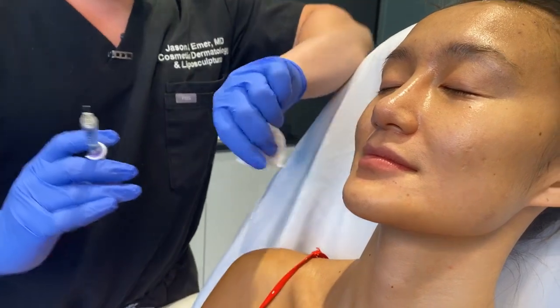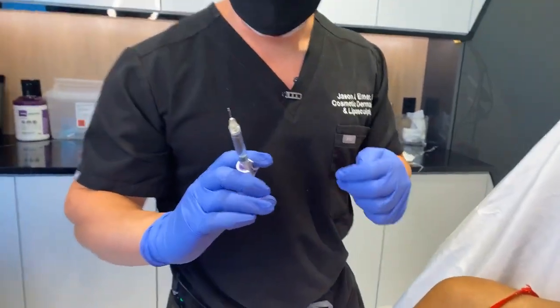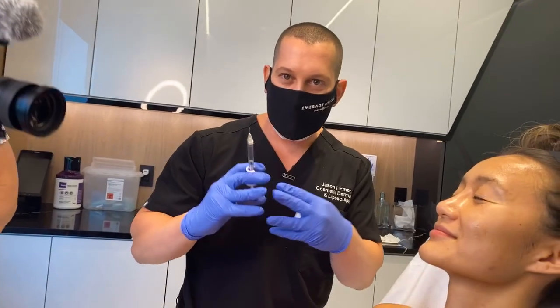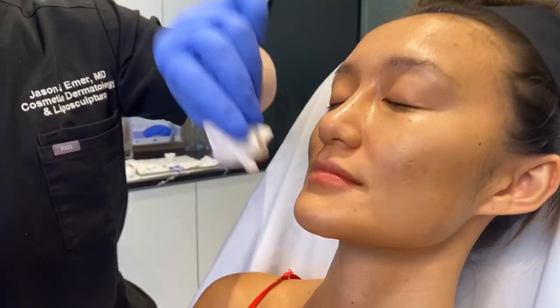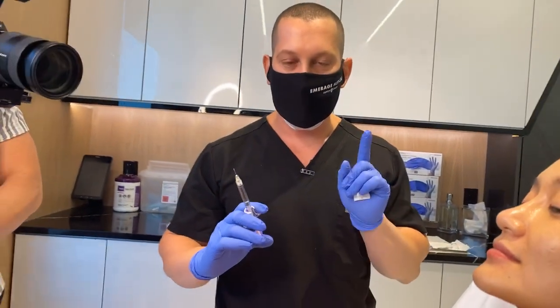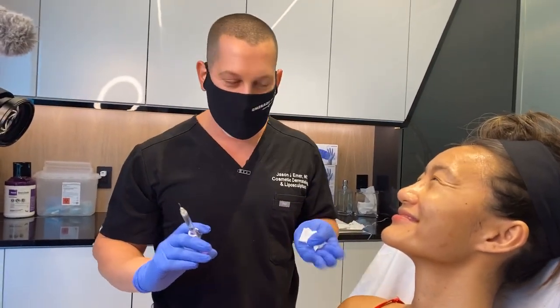They asked me anything? Yes, they asked. This is Juvederm VOLLURE. It's one of the longer lasting of the Vycross technology fillers. That's just a special type of cross-linking that makes the filler last longer. Now, just so you guys know, if you do a little research, these fillers are the only ones that have been shown to have long-term issues if you use a lot of it. So you want to use little bits. As long as you use a little bit, you're totally fine. That's why we only do a small amount.